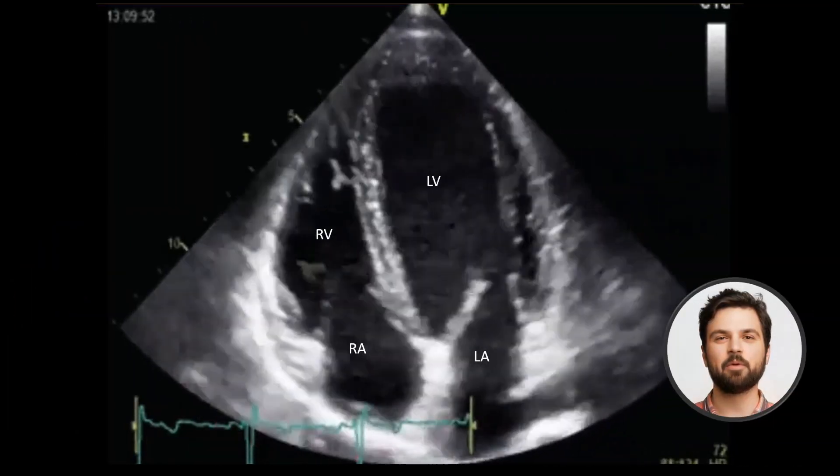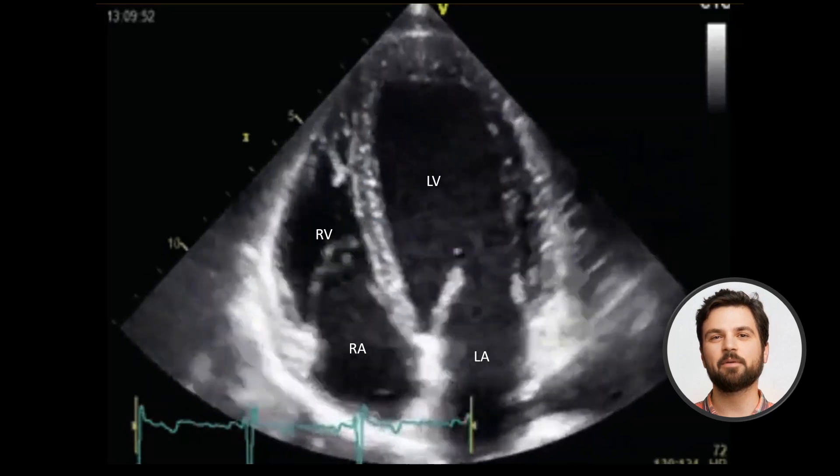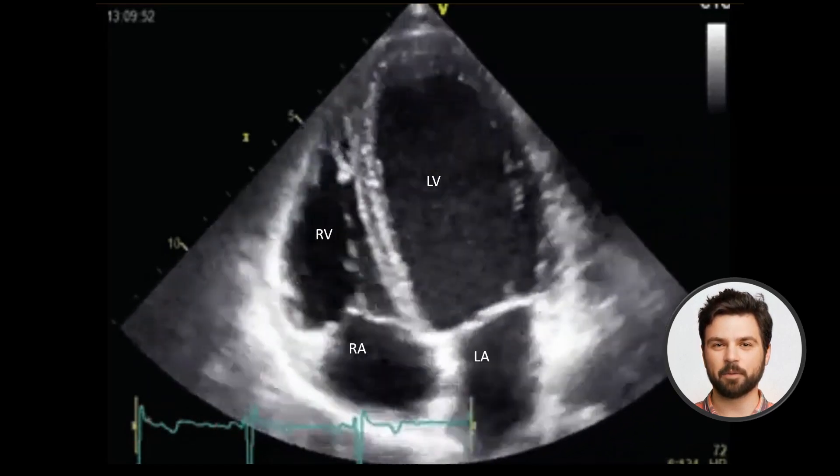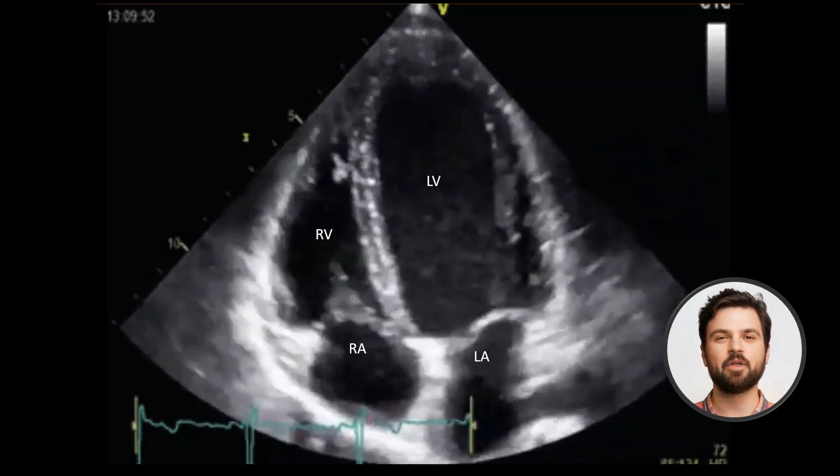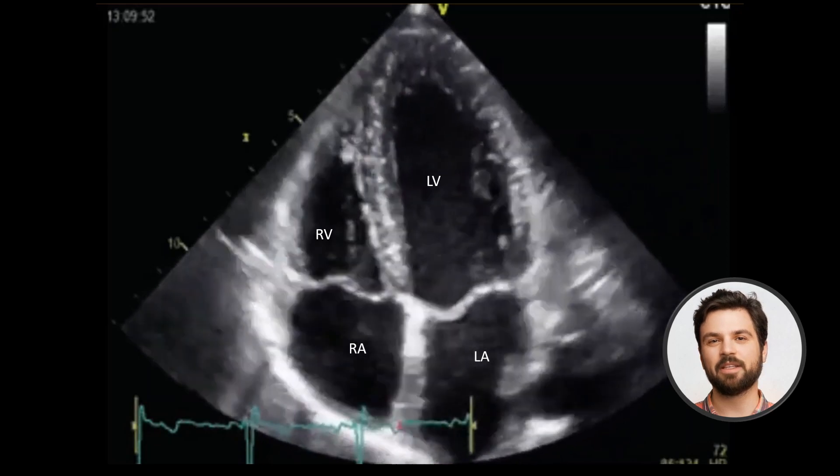The apical 4 chamber view is great to get an overview of cardiac structure and function. All 4 chambers are seen, along with the mitral and tricuspid valves. The anterolateral and inferoseptal left ventricular walls can be evaluated in this view.